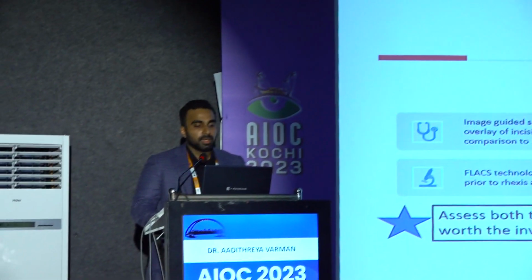So I conclude by saying image-guided surgery assists the surgeon to perform precise steps by having an overlay of incision in the cataract, rexis size, and toric alignment as well. Femto technology uses OCT-based imaging to map the structures prior to the lens fragmentation. So assess both the technologies to determine if the benefit is worth the investment to your practice.